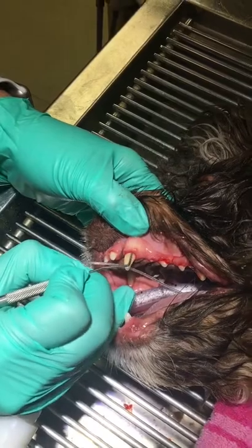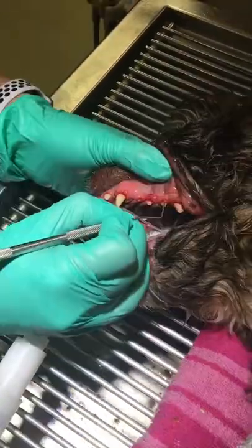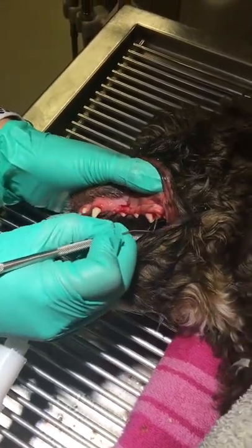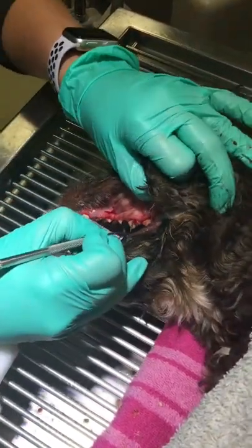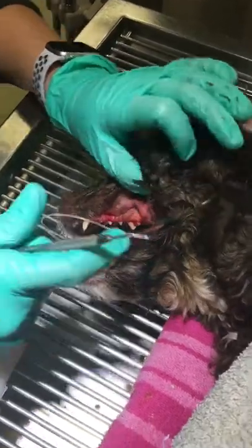Checking for pockets should be done on every side of the tooth. Keep the side of the tip of the probe in contact with the tooth using a light touch. The probe is walked around the circumference of the tooth with short up and down strokes every few millimeters. Normal depth in a dog is 0 to 3 and in cat 0 to 1. Anything greater is a pocket.